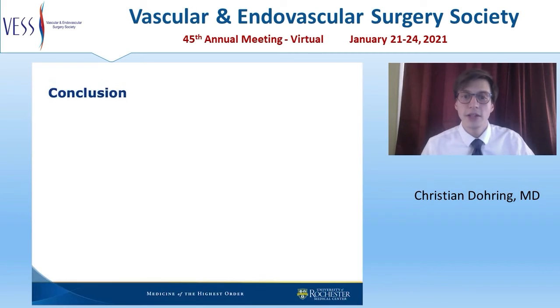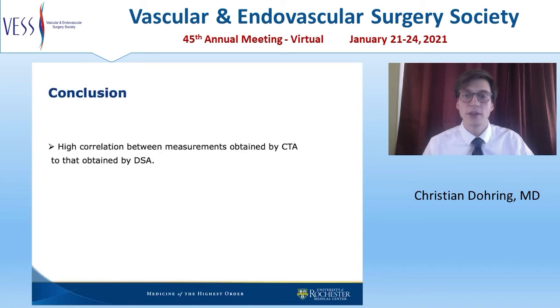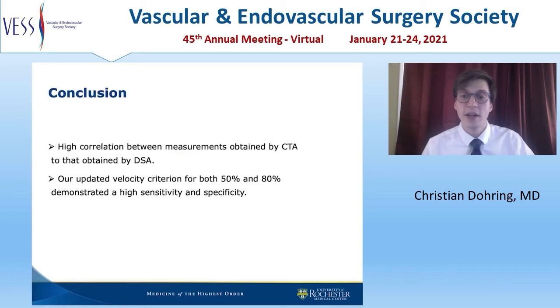In conclusion, we addressed the possibility of inaccuracy of CTA measurements by comparing the results to the traditional gold standard, angiography. Our data demonstrate a high correlation between measurements obtained by CTA to that obtained by DSA. Additionally, our updated criteria demonstrated a high sensitivity and specificity.